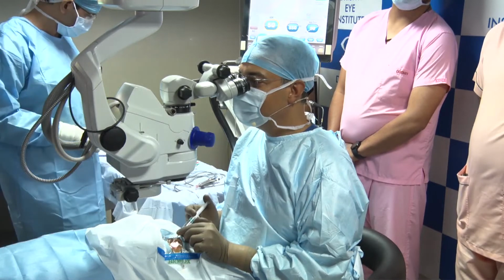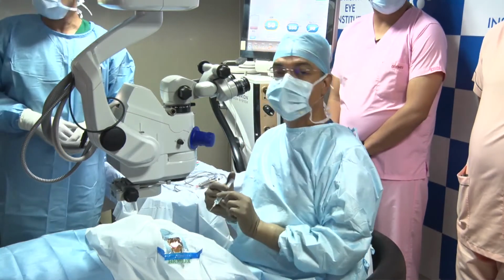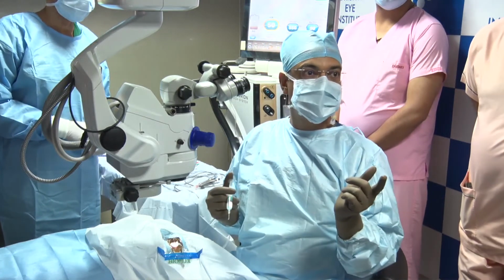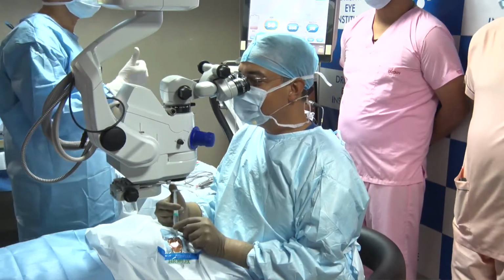and I'm going to close up, and if everybody is happy, then we can move on to the other OT where Dr. Arun Jain is already waiting with his case. Beautifully done surgery, Dr. Gaurav. Excellent. Who's in the other OT? What is the incidence of doing PI in such cases? Achha, Dr. Kumar is in the other OT. Do you do PI?